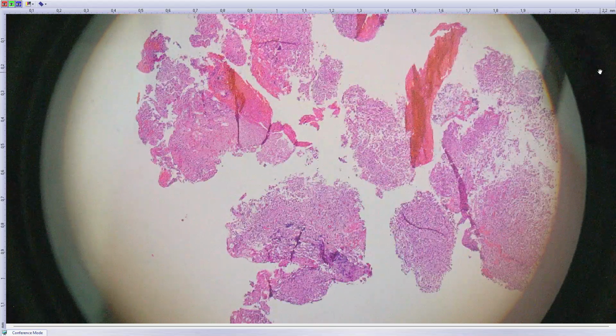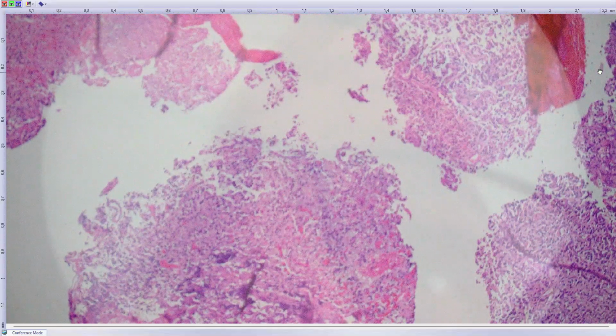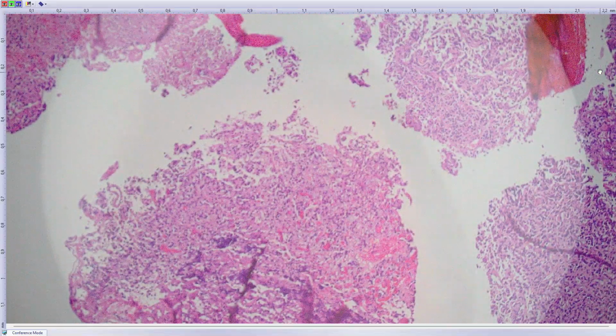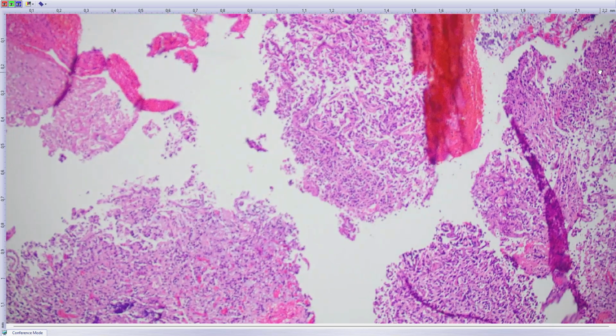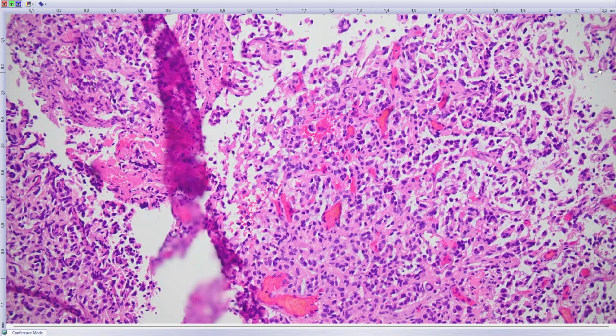Now we've got another case. In fact, these cases came maybe a week or two apart. Again, it's a quite young person, female, and it was a tumor of the pineal gland region, and it was sent with a diagnosis of some kind of weird pineal gland tumor, which I believe it is not, just by looking at H&E.